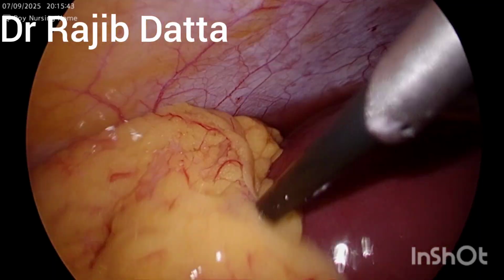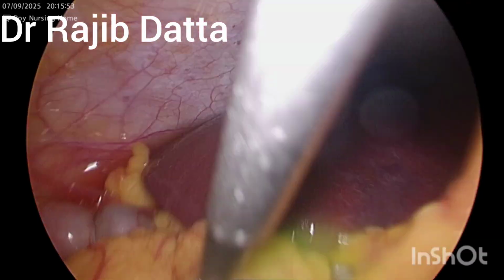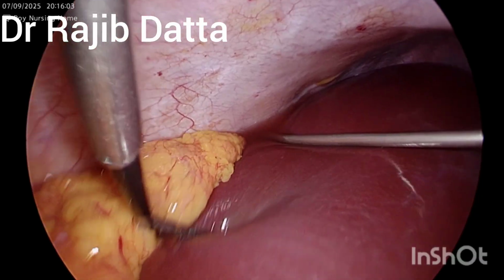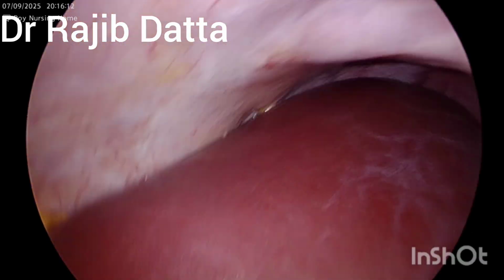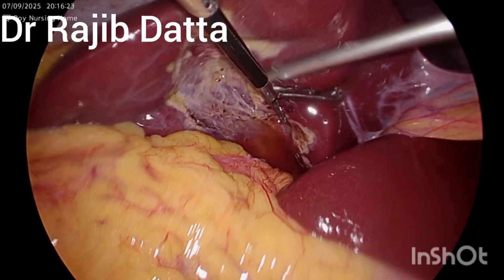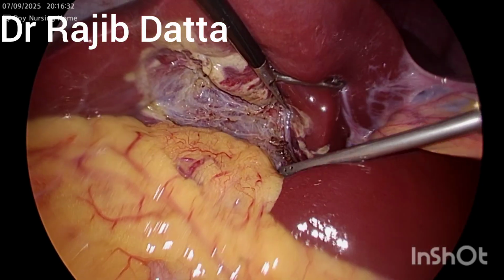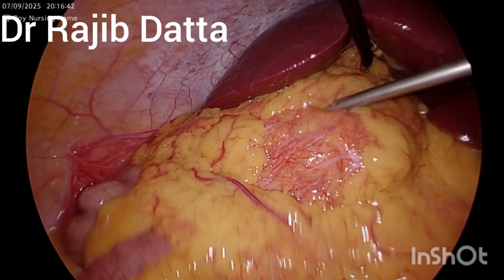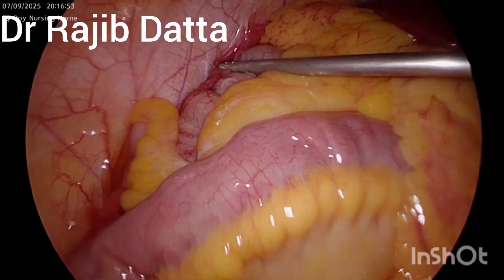So our job is almost done, and I will prefer here to apply the omentum into the liver bed, that is the gallbladder fossa, and it will take care of the hemostasis and small oozing, and it is the abdominal policeman, so it will take care of anything. So you can appreciate that there is no bleeding, and I am just putting the omentum within this gallbladder fossa of the liver bed. So our job is done.